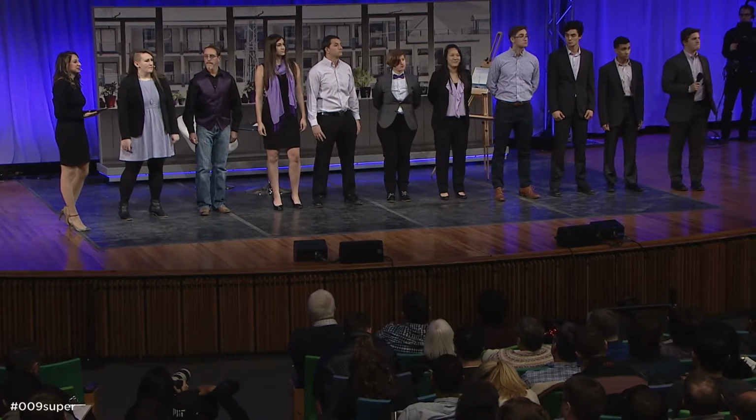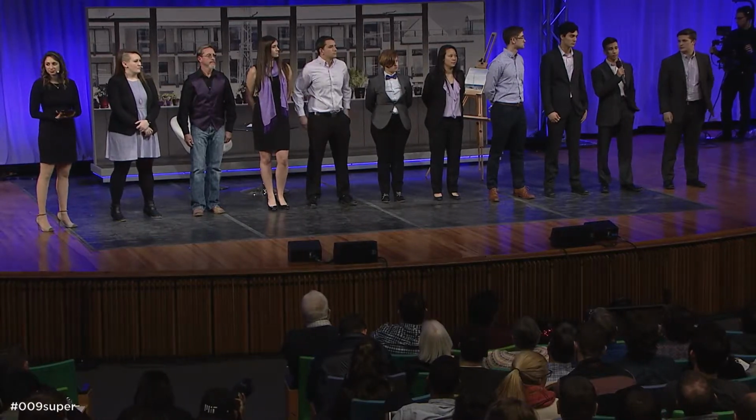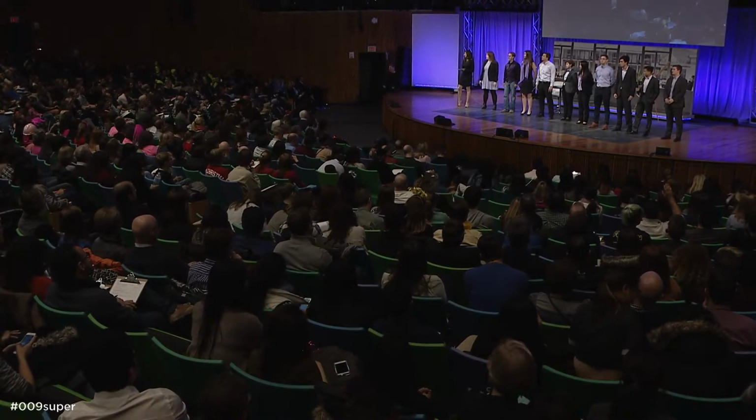Up here? You mentioned that there were several settings for different people. So what kind of settings do you have? Is it different frequencies or what else? Yeah, it's a great question. So currently we only have different frequency states that Animo cycles through. We plan, in future iterations, to have different parameters that we can change. One that comes to mind is amplitude, and seeing how varying both the amplitude and the frequency can optimally reduce the tremor.